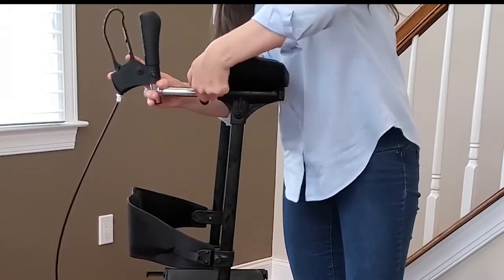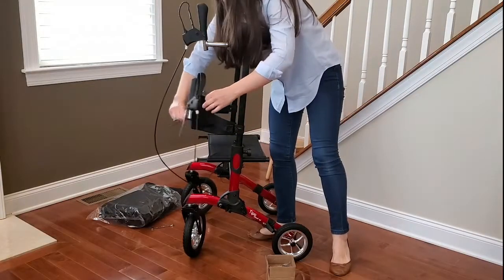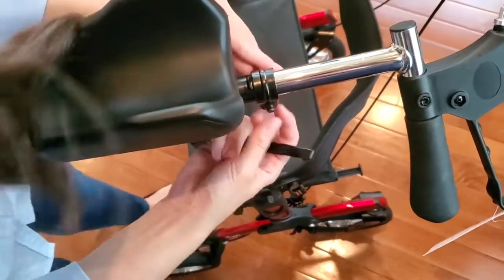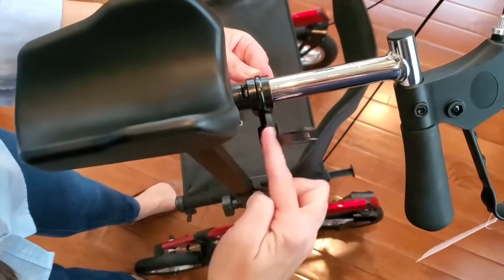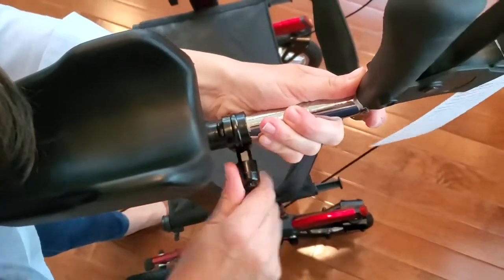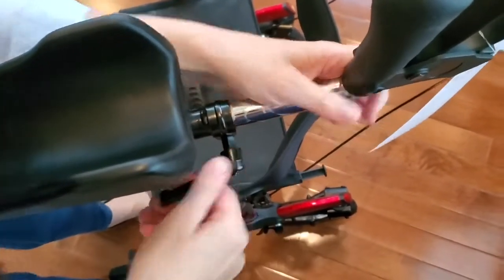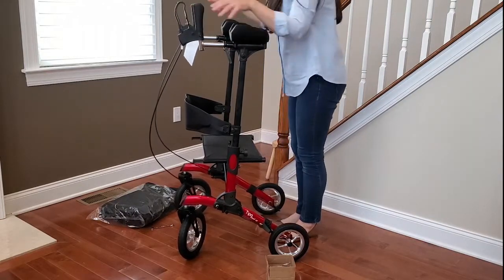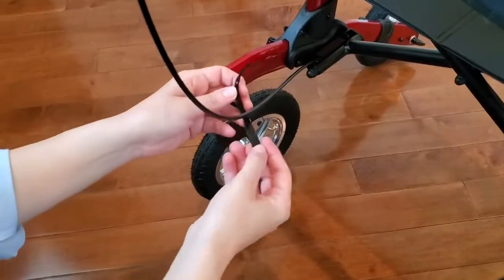Once it's settled on the number, tighten it up. Now insert the handle — the screw goes from the inside of the walker to the outside. Use the locking knob on the other side to tighten it up. Adjust it to your desired position and tighten it all the way. Once your handles are super tight and in the right position, we're going to use the little Velcro piece to keep the brake cables together.